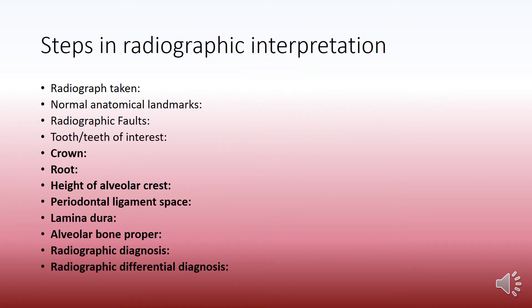The steps in radiographic interpretation would be the same as usual. First of all the radiograph taken, normal anatomical landmarks, faults if any, the tooth or teeth of interest, crown, root, and height of alveolar crest.